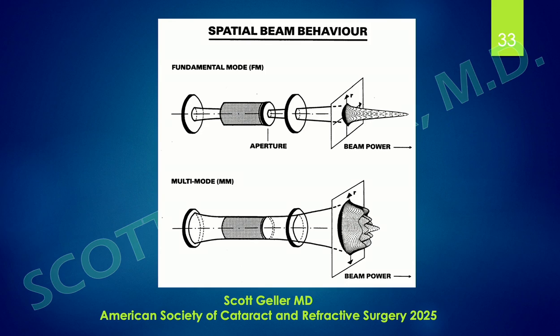However, you can also change the wave front or the mode of the beam with a larger aperture, and you get a wave front that has several bumps in it. It has the fundamental mode, which is the ice pick at the center, but it also has several other beam modes, and the combination of this gives it much more power, sort of like a sledgehammer.